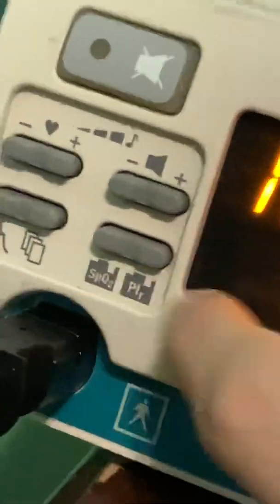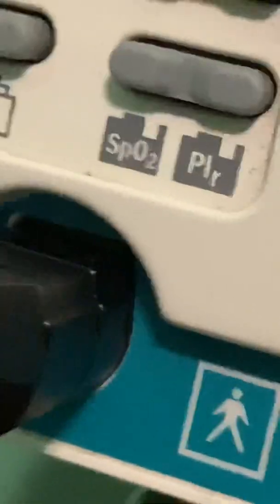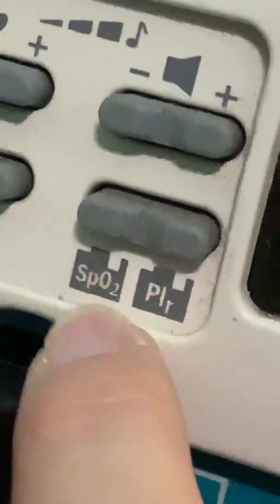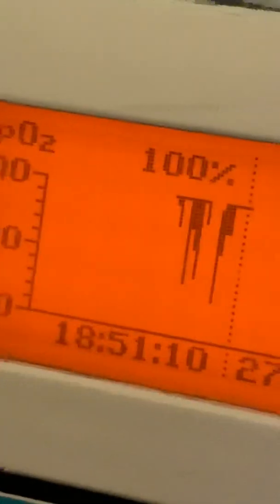These buttons right here are how you look at the 24-hour history of the oxygen saturation and the perfusion index. If I press the SpO2 button on that side, you will see the trend of the oxygen saturation, so you can get a trend of the patient's data and go back and forth.